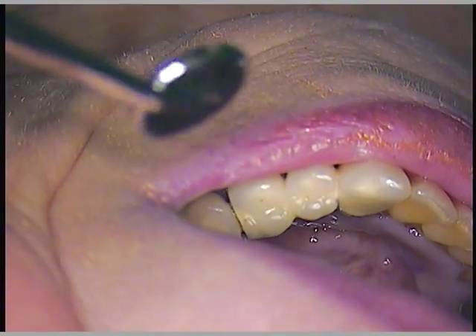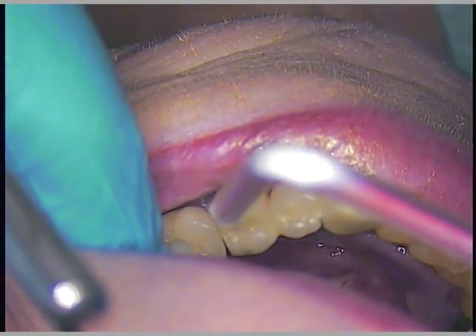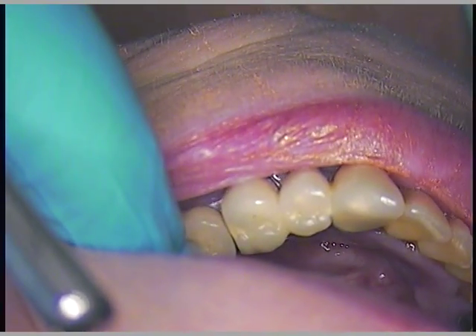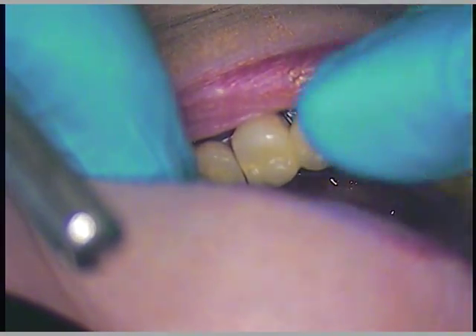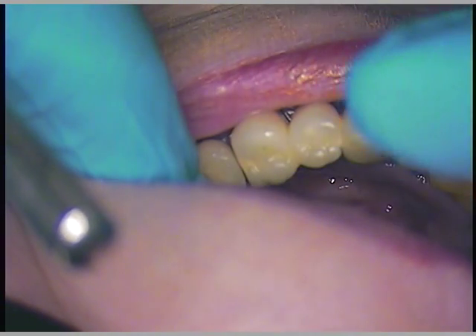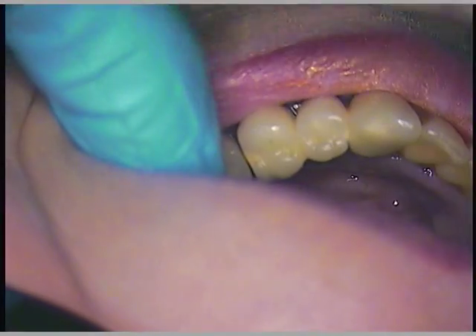First things first, we'll bond this tooth to the adjacent bicuspid, then we'll remove the bonding. There is a pre-existing space reported by our patient that the previous dentist was aware of, so we offered to tighten that up for her today as well. At the end, we'll add a contact.